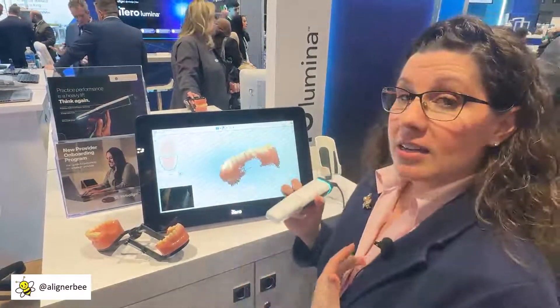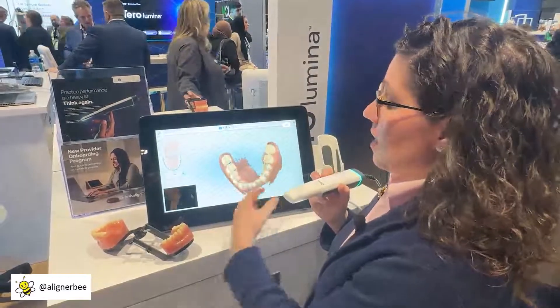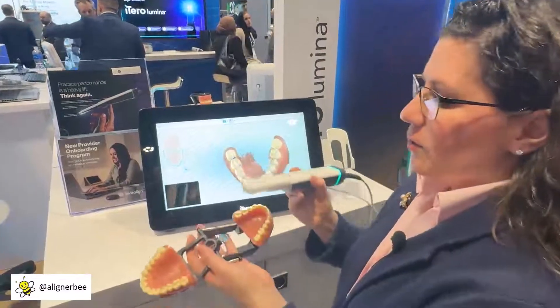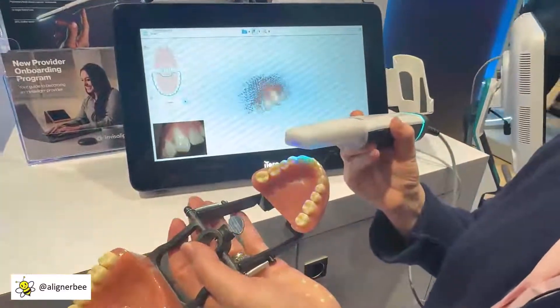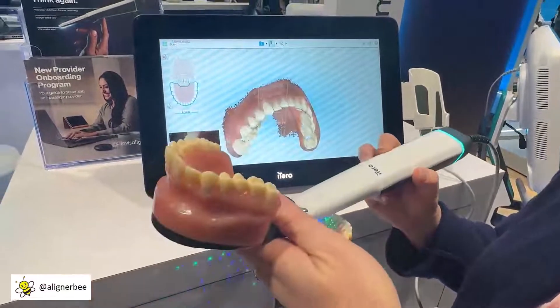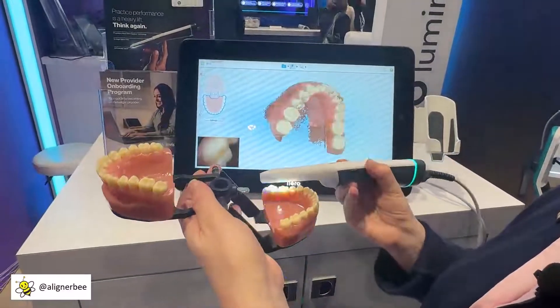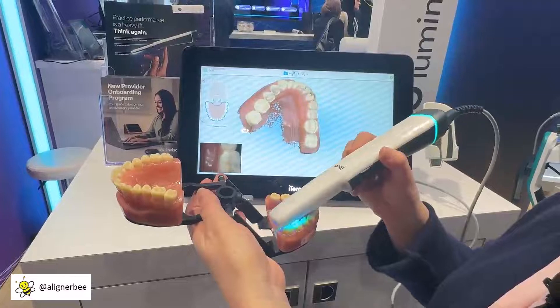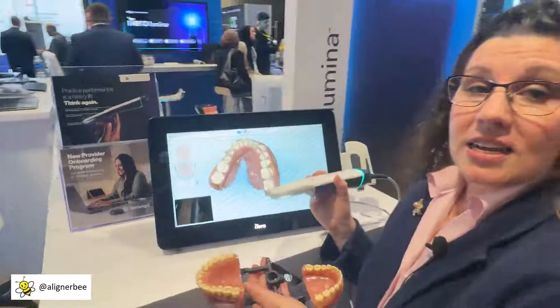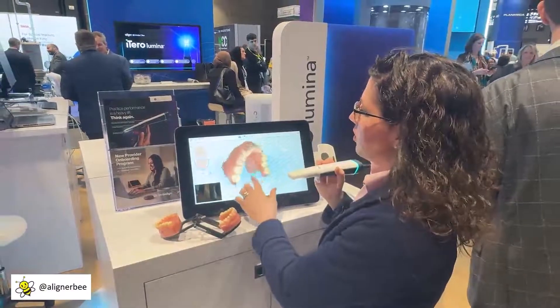For my clear aligner cases, I want to make sure to capture a little bit more soft tissue. The software can fill in a few of those spaces, but I can easily recapture a few of those interproximal areas where I want a few more data points. In less than 60 seconds, I've captured the lower arch.